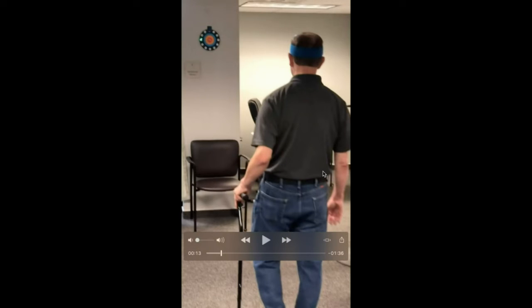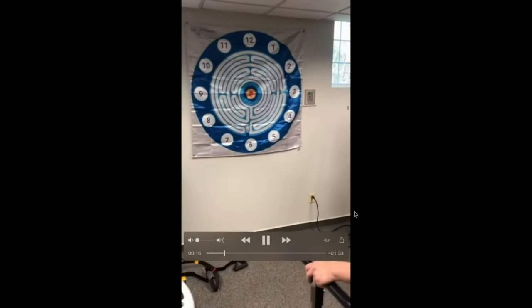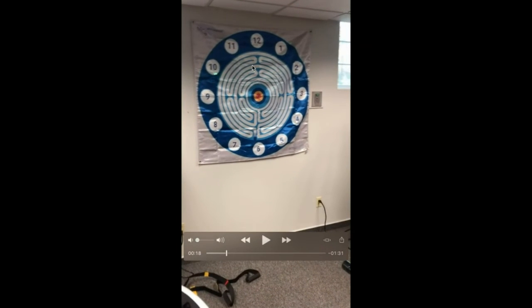So he is using this for training of upright posture, gaze fixation out into the community rather than typical gaze fixation, which is down here at the floor, and working on that through different functional patterns. Then he's getting them to do different things. So if we play this video further, he's using our motion guidance maze with the JPE flag on it and the clock overlay to get them to do cognitive challenges. So go to a certain number based on some math. We showed this earlier in the live stream, and coming back to the middle.